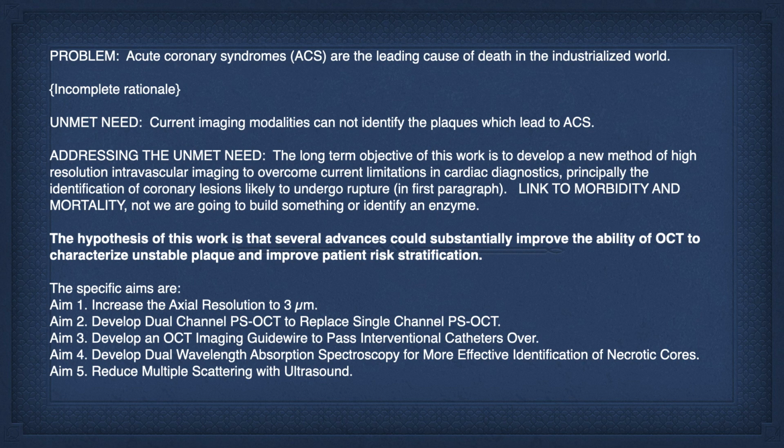Acute coronary syndromes like MI are the leading cause of death in the industrialized world. And then we need an unmet need. Current imaging modalities cannot identify the plaques which lead to ACS. Now, there's actually a problem in that jump. There are multiple problems on this slide, and we're going to come back to it. I'm going to try to use it to illustrate hypothesis-driven work.